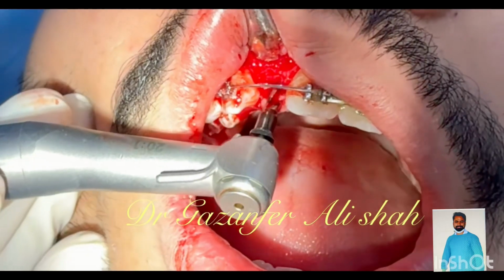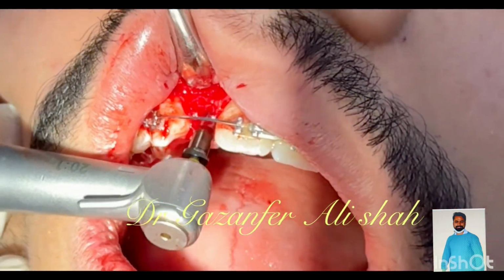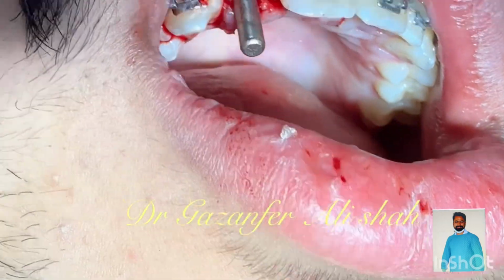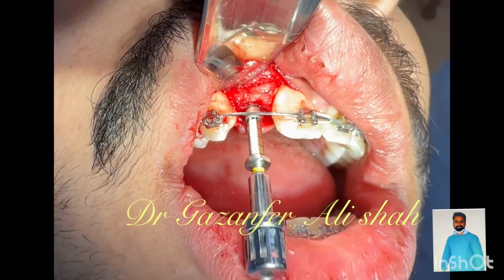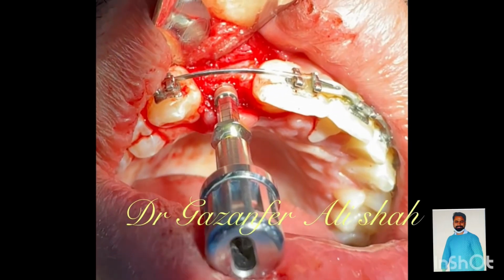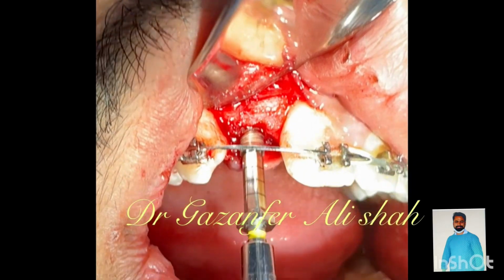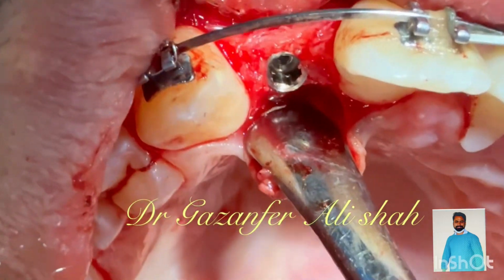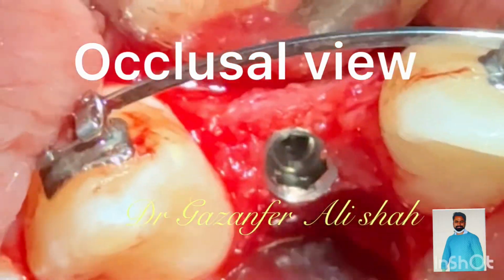After extraction of the tooth, we are reflecting the flap and making the osteotomy with a pilot drill. To check its angulation with the adjacent roots, we use a guide pin and take an IOPAR to check its angulation. After that, we are using sequential drills, 2 mm and 2.8 mm. Our final drill should be 0.5 mm deficit from the implant fixture to achieve primary stability.